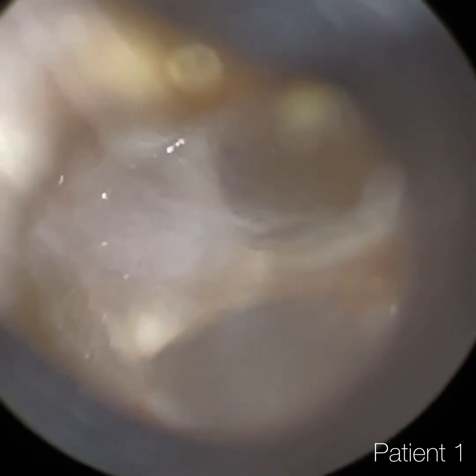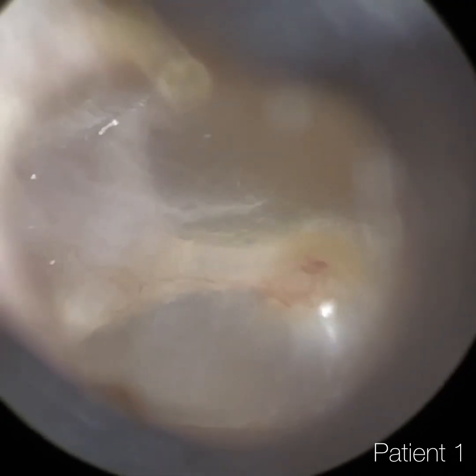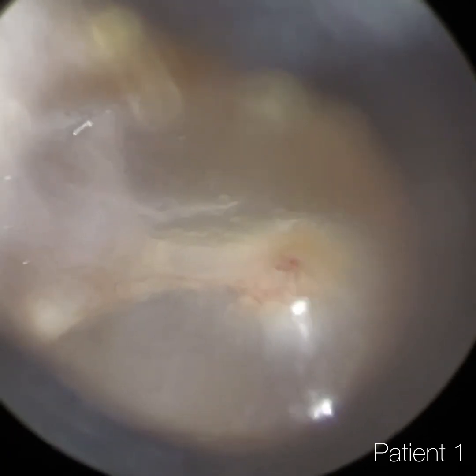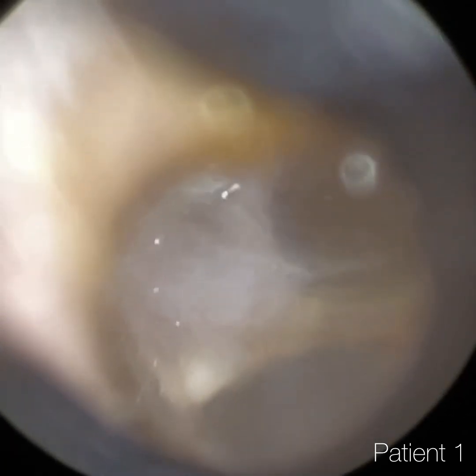And you can see this is patient one's left ear. We managed to remove that wax really straightforward, and you've got a lovely view of the eardrum there — it's nice and focused. You can even see the Chorda Tympani.